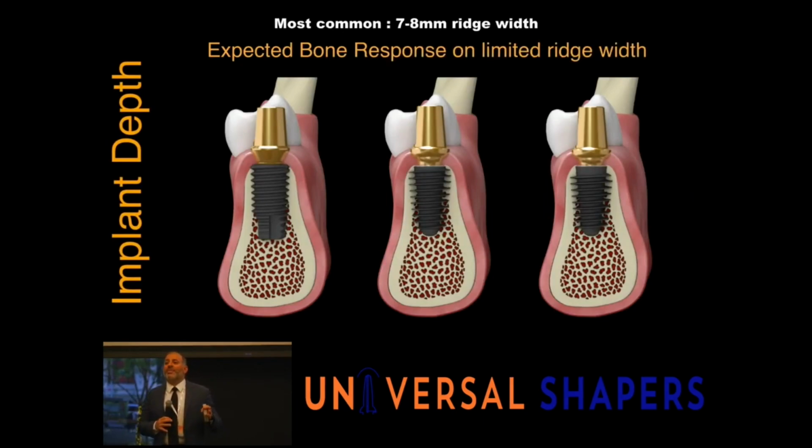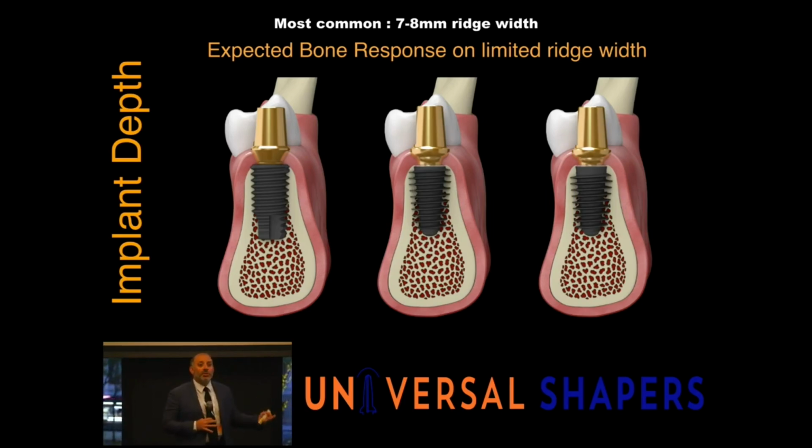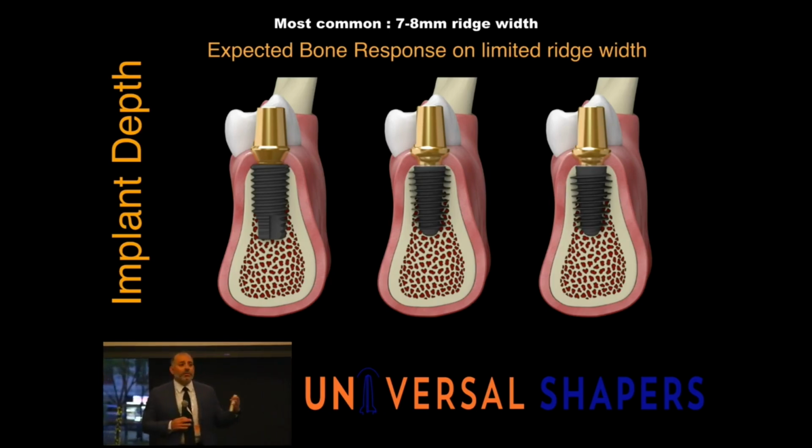So these different designs are important, but also the depth of where we place the implant is extremely important. Certain implants need to be placed at bone level, others subcrestal. How much subcrestal varies from implant company to implant company, often dependent upon the type of connection. And these more conical design implants can be placed a little bit deeper.